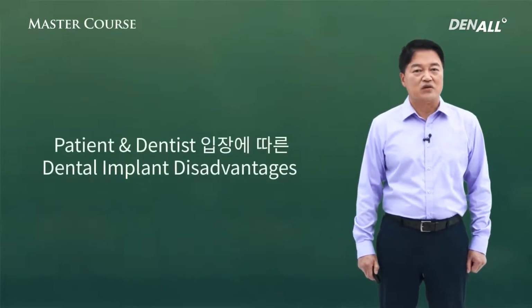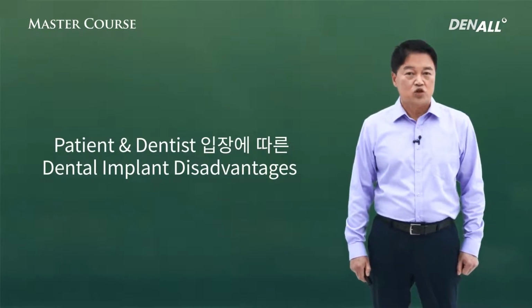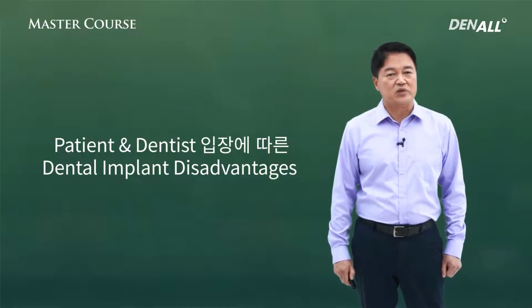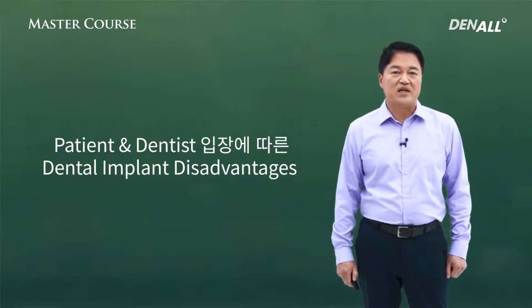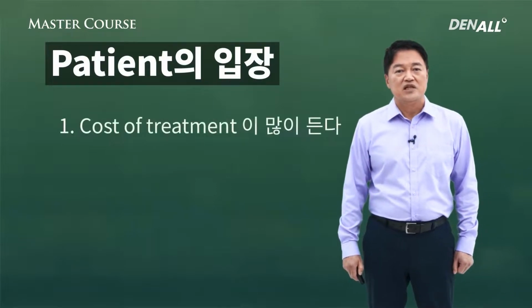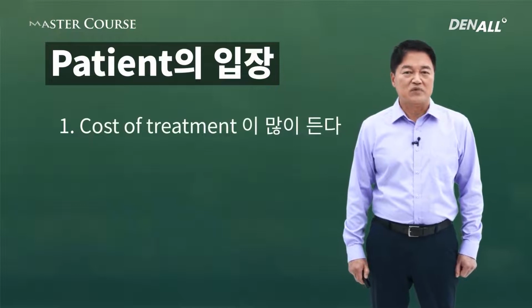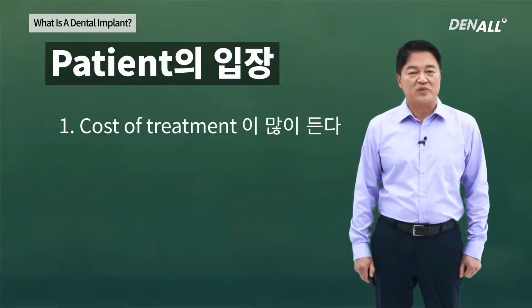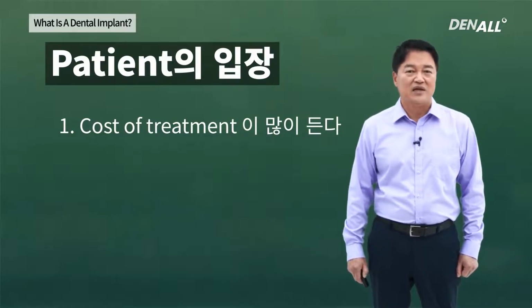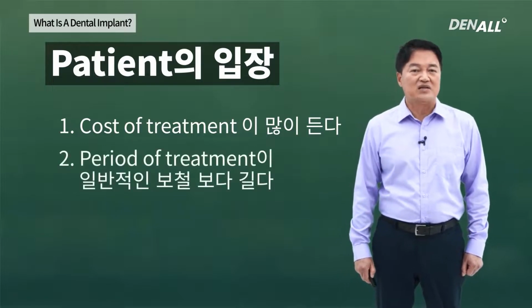Implant is not without shortfalls. Let's look at disadvantages of implant, depending on patient and dentist perspectives. From the patient perspective, first, the treatment cost is quite expensive. However, these days, implant treatment can be insured and the treatment cost has been reduced, so this is not a huge factor. Second, treatment period.